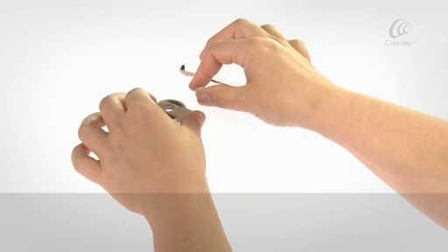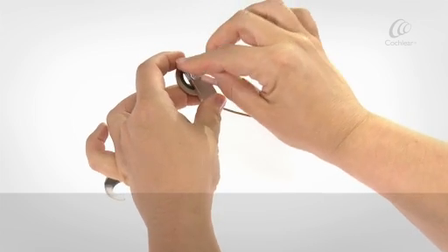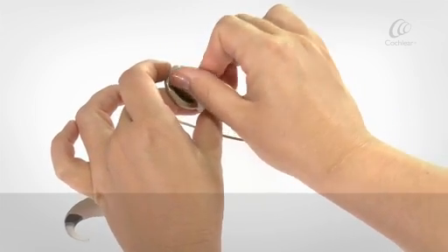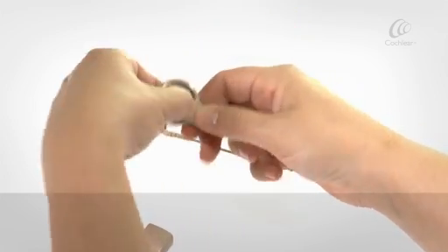To assemble your sound processor, insert the coil magnet into the coil hole and turn it clockwise until it's at a comfortable depth.